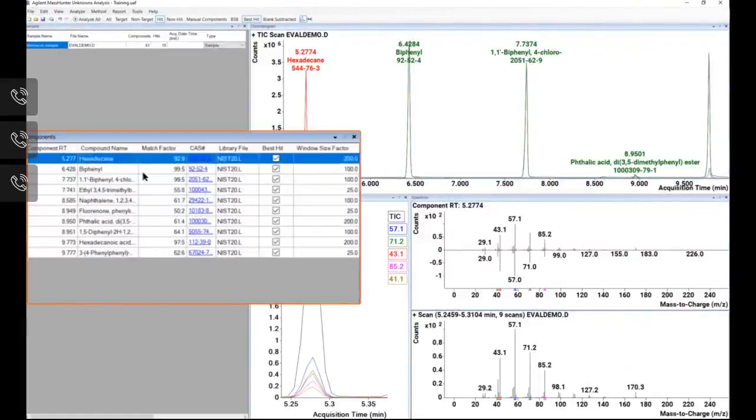Now, some QC people may not like that factor, but it is something that you can do as far as changing it, especially if you want it to be in your library and not in another commercial library that you might be searching at the same time.